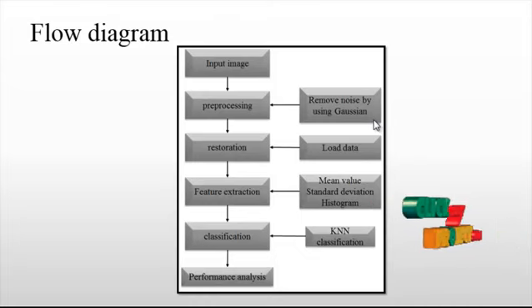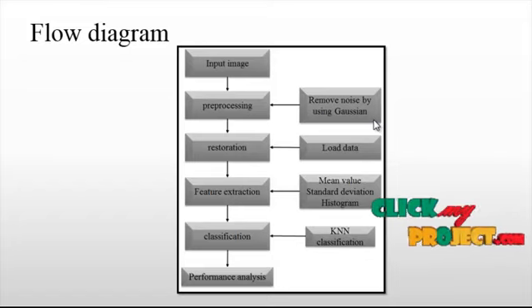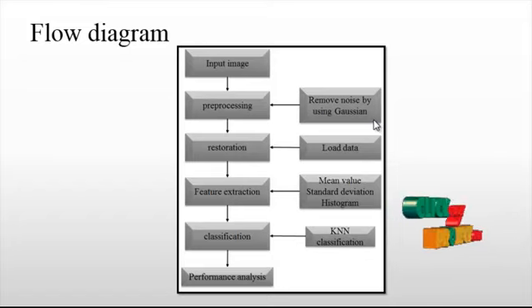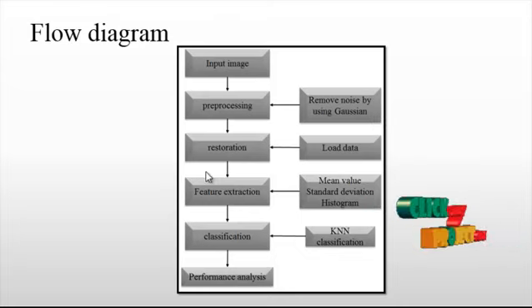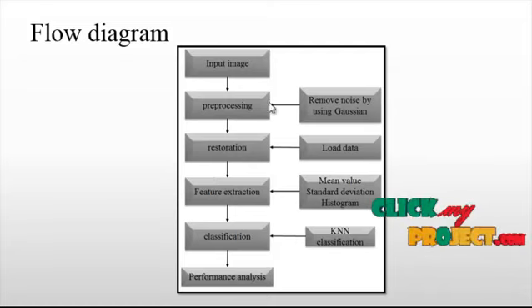The visual effect of this blurring technique is a smooth blur resembling that of viewing the image through a translucent screen, which is different from the bokeh effect produced by an out-of-focus lens or the shadow of an object under usual illumination. So this is the pre-processing step in the flow diagram.